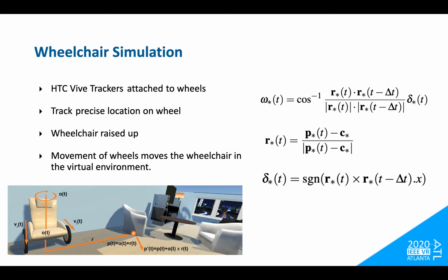In our simulation approach, the wheelchair is always facing along the z-axis. Wheelchair movement in the simulation is done by translating and rotating the scene rather than the virtual wheelchair. For example, when the wheelchair seems to move forward in the simulation, it actually remains static while the scene moves past it.